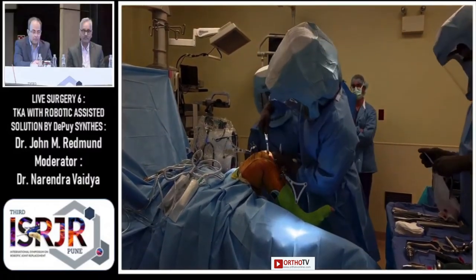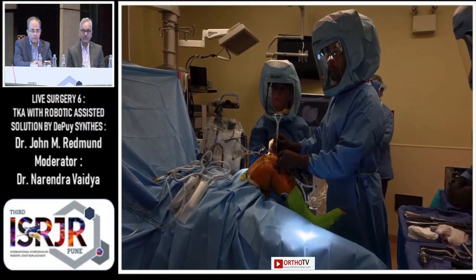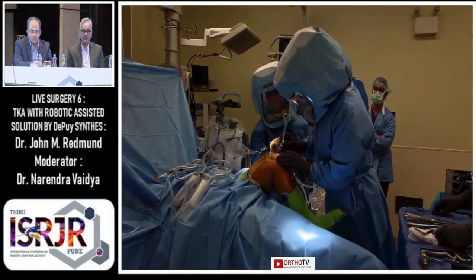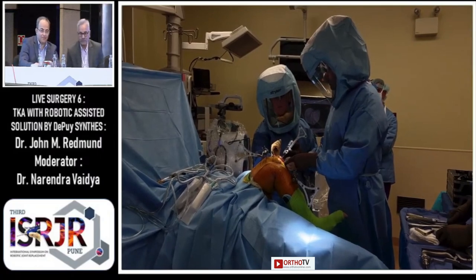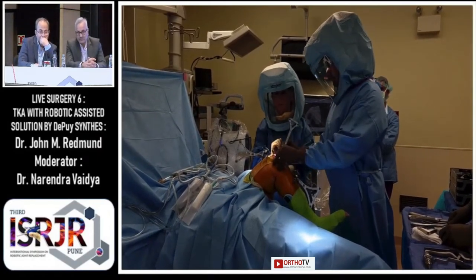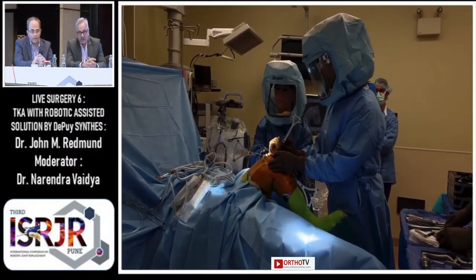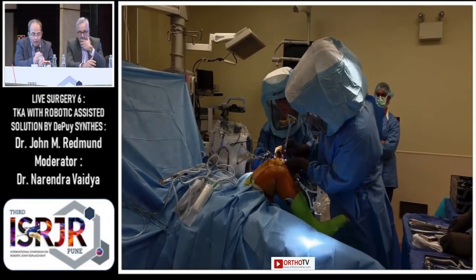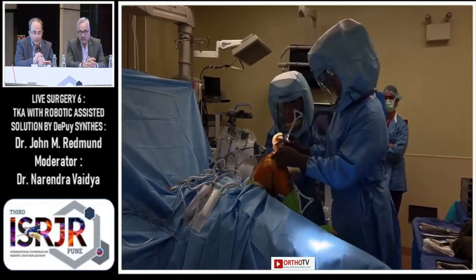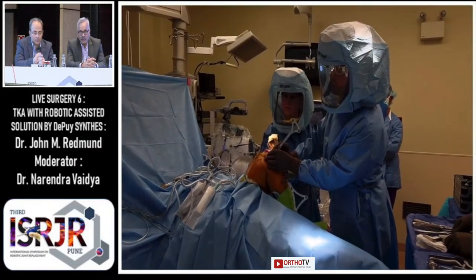I'll have an assistant hold the extensor mechanism out of the way and start taking points on the tibia. The top of the mechanical axis of the tibia — we take a point in the center of the footprint of the ACL. This is an imageless system, so no CT scan or MRI is required. I then take points on the medial and lateral tibial plateau for resection levels, and define the AP axis and slope of the tibia. Tibial registration is quite simple — just five or six points: mechanical axis, slope axis, and resection levels on the medial and lateral plateau.